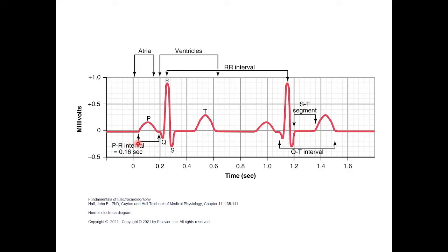How do we know this interval is increased? We said the PR interval is very important. How do we know whether this interval is increased or not?